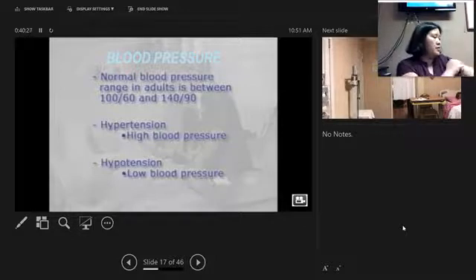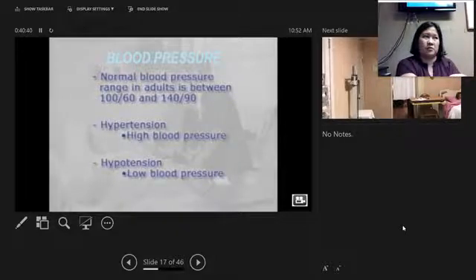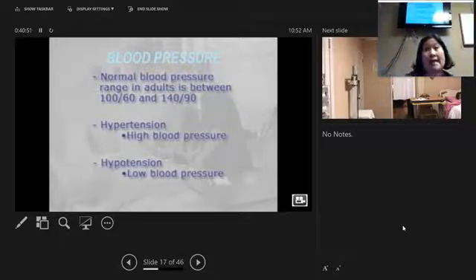Just make sure that you're putting your cuff at least an inch above the bend of the arm, because when you put your big stethoscope diaphragm on there, you don't want it tucked up underneath the cuff, because it'll make noises and then you'll think that those are the sounds for the blood pressure. We're going to practice it a lot, but once you hear the thump, you're going to know what you're listening for. So you pump it up between 160 and 180.